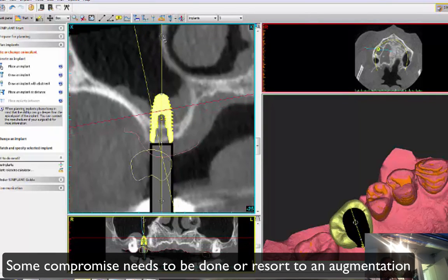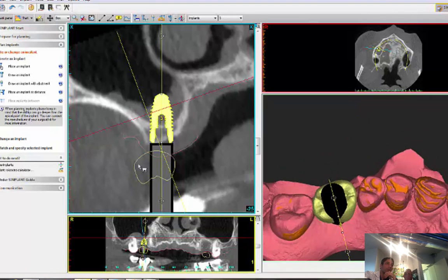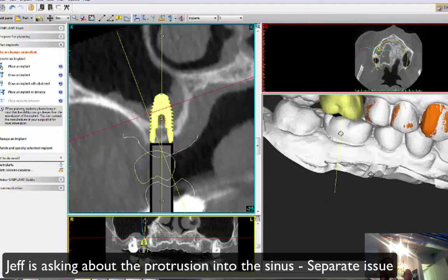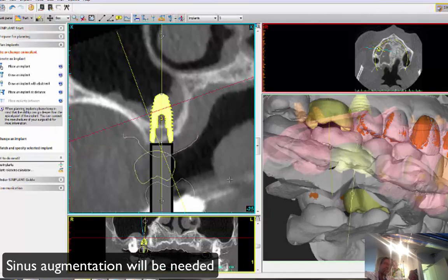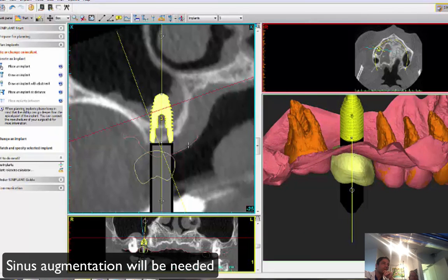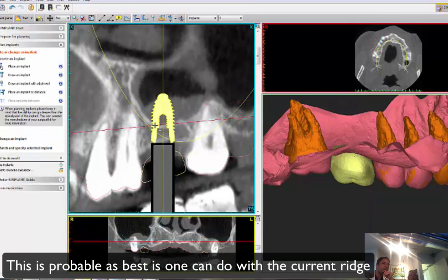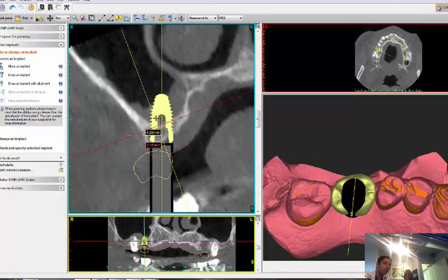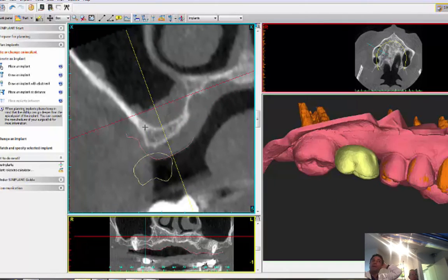I can probably tilt the implant to the buccal for better screw access, but there's going to be a pretty big cantilever component. She'll have a tooth, but 6 millimeters of the implant going into the sinus — that's a separate issue. We need to do a sinus lift. If I get the implant in a proper mesiodistal angle with good restorative space, I may have to bury it a little bit deeper. This is a compromise case — you have options for this patient.